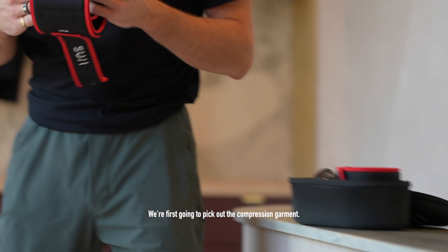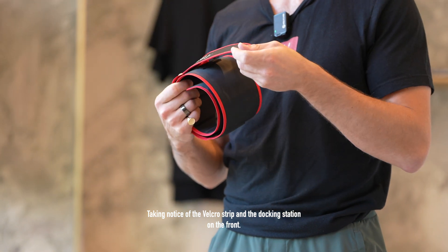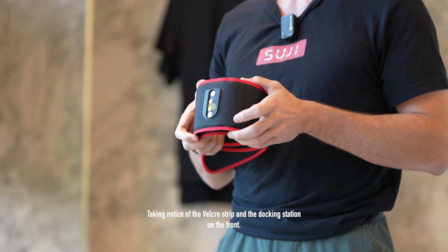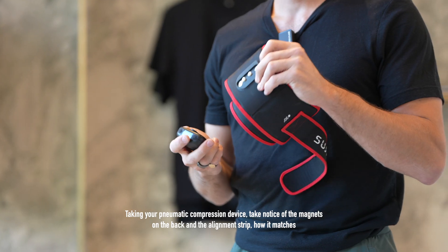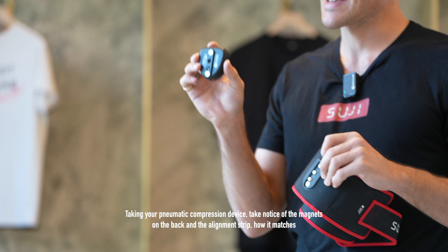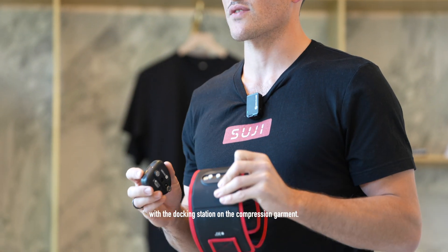We're first going to pick out the compression garment, taking notice of the Velcro strip and the docking station on the front. Taking your pneumatic compression device, take notice of the magnets on the back and the alignment strip, and how it matches with the docking station on the compression garment.